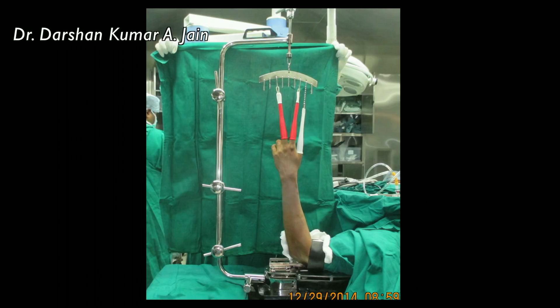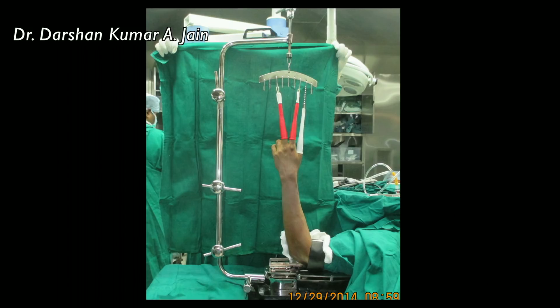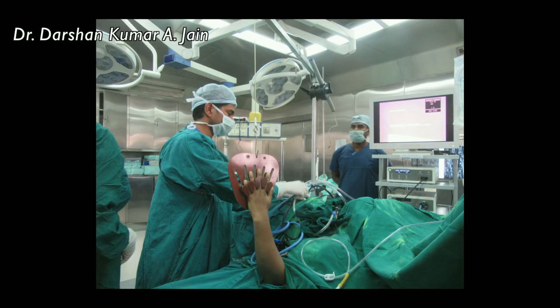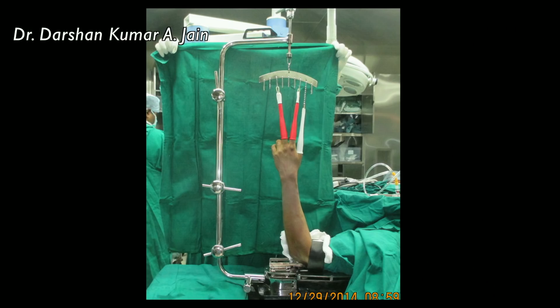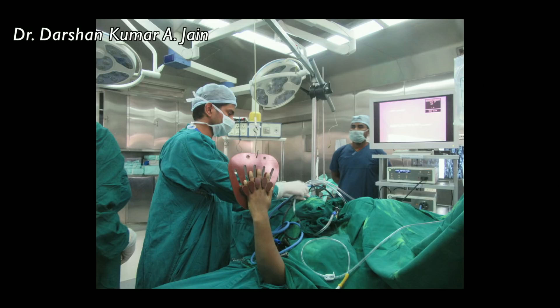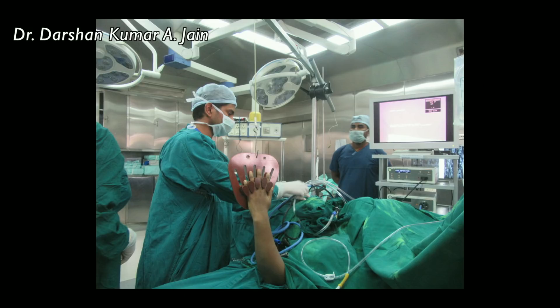Arthroscopy is performed using a wrist traction device. These are the various devices which are available — a custom-made one using Chinese finger traps, or another wrist traction device which can be attached to a shoulder traction unit and done with three to four kilos of weight.